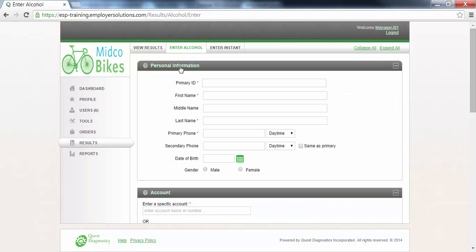If you do not see the enter alcohol tab at the top of the page and need access to this function, please contact your organization's system administrator to be provided access.